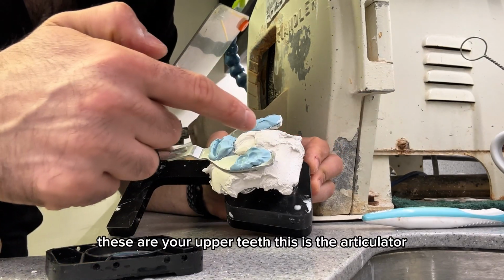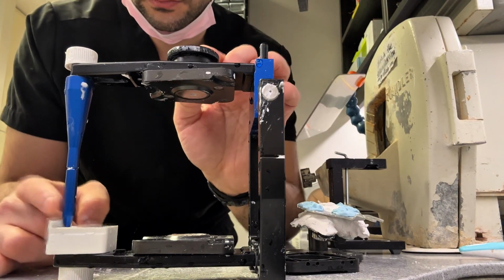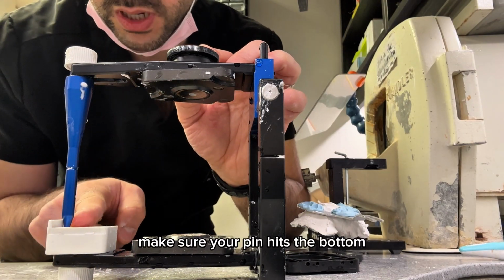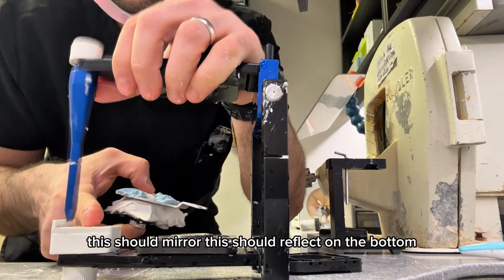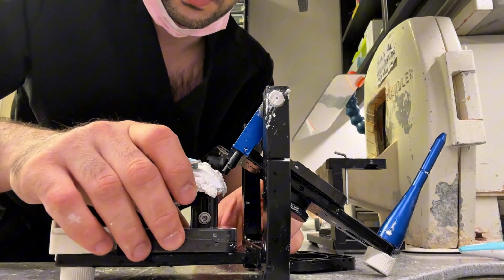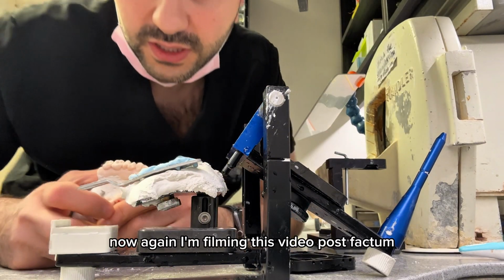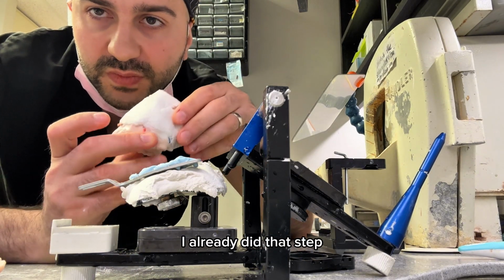These are your upper teeth. This is the articulator. Make sure your pin hits the bottom, the base in here. This should mirror, this should reflect on the bottom. So now again, I'm filming this video post factum. I already did that step.